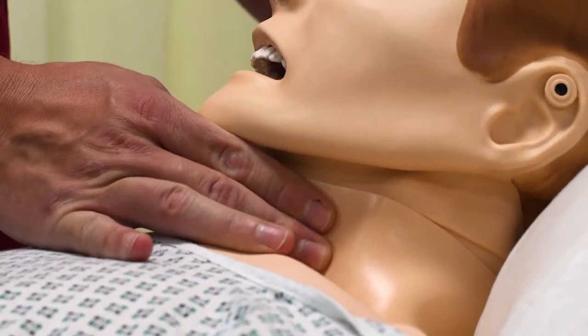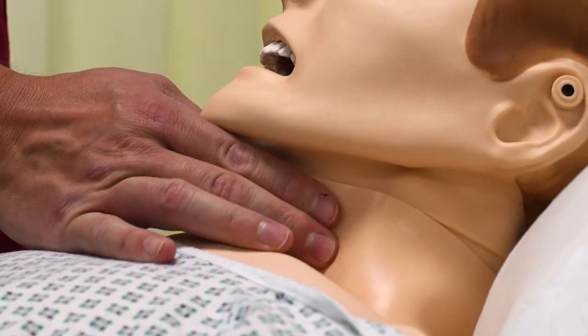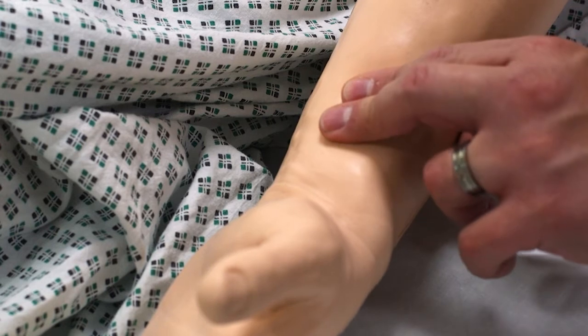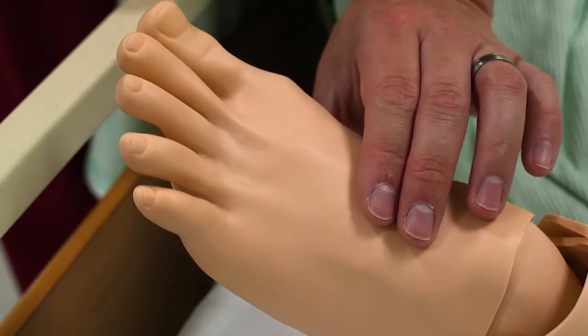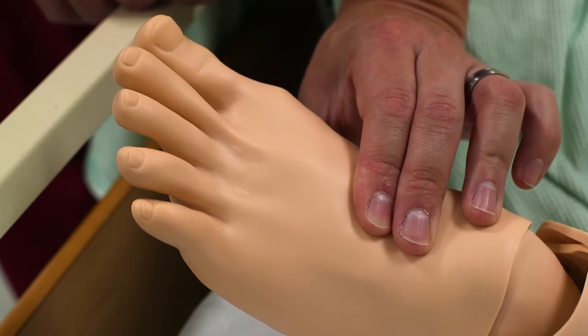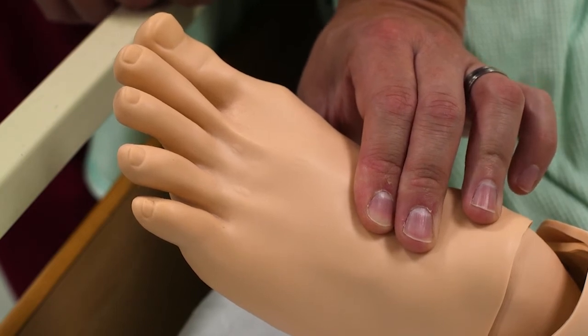This mannequin has full pulses both centrally and peripherally. To activate the pulses, initially press down firmly and release. During the scenario, the pulses will start to cascade like a real patient. Therefore, in any emergency situation, feel for a central pulse.